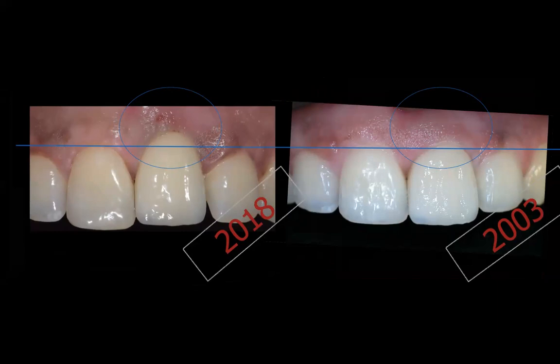What happened here? Now, I want to bring to your attention something else that Arnold Weisberg has a research and a paper done on it. Take a look at the incisal edge of the adjacent tooth. Look at my case in 2003. Look at the case now, in 2018. This is 2 years ago. What happened here? Did the implant get shorter? Crown is the same. Everything is the same.